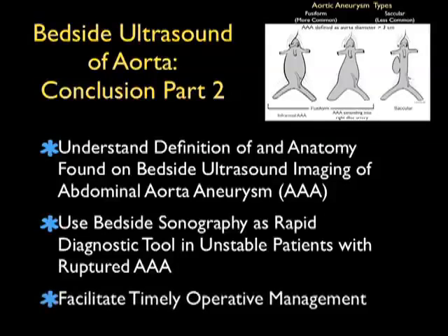Remember that if the patient has unstable hemodynamics and a large AAA is seen on bedside sonography, that patient must be assumed to have a rupturing AAA. Using bedside sonography, we can facilitate timely operative management of these patients and possibly save a life.